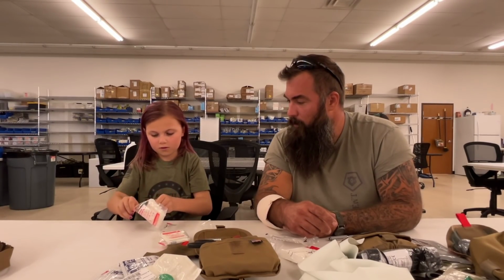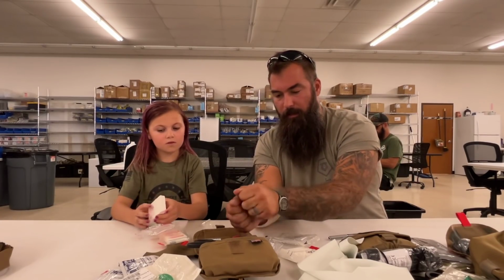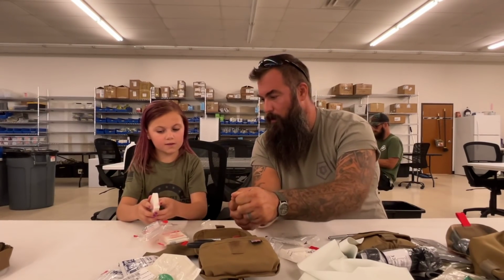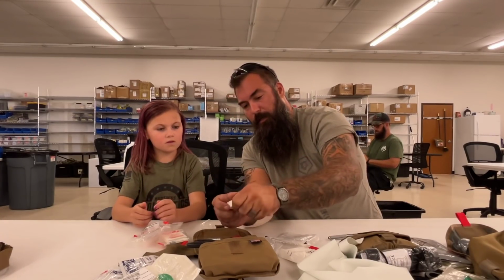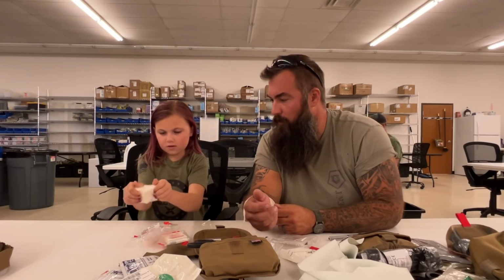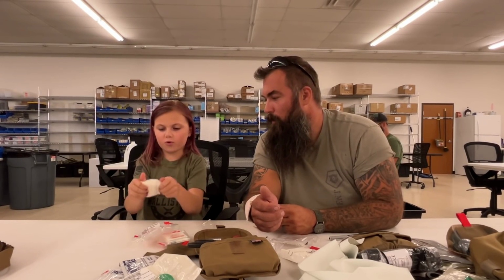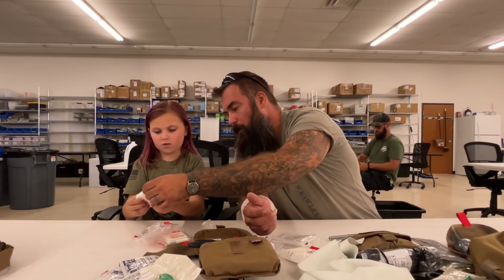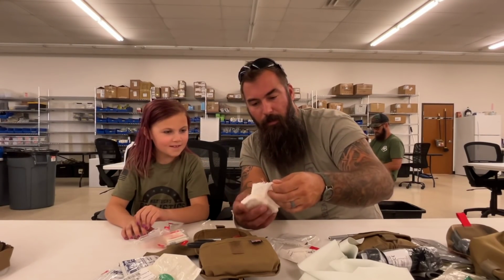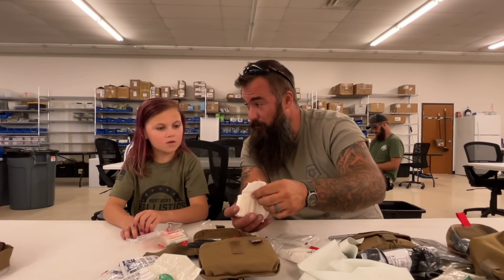Pull it out. And then when you get it in your hands, get it like this and kind of smush it back and forth. Like this? Like that. Wiggle it back and forth. Okay, flip it over. Wiggle it back and forth. Oh, I've seen gauze before. Okay, so now, somewhere in here, there's the start of it. Have you ever seen this fully unrolled?